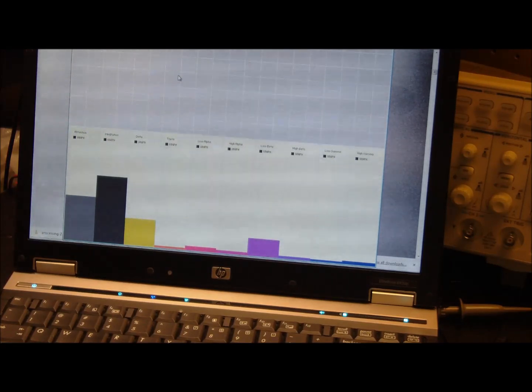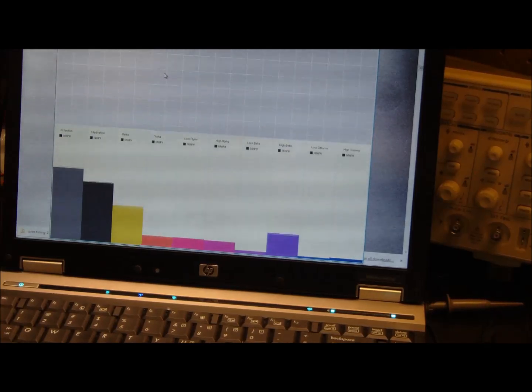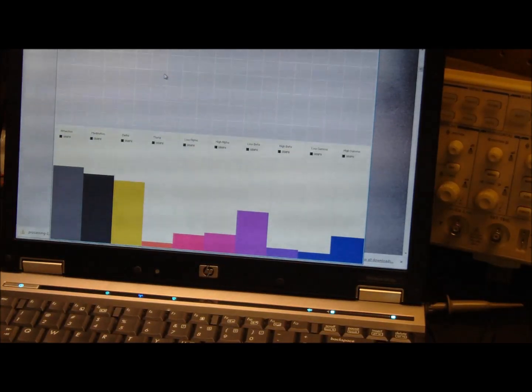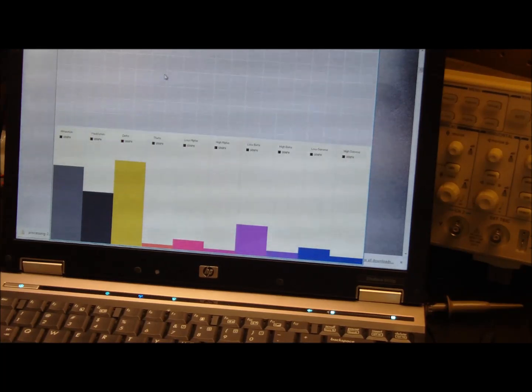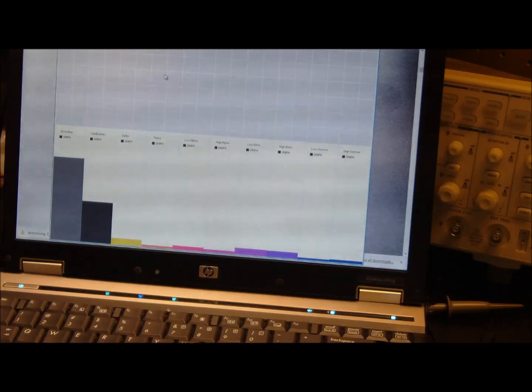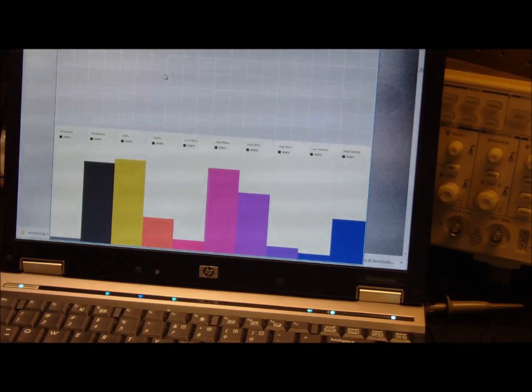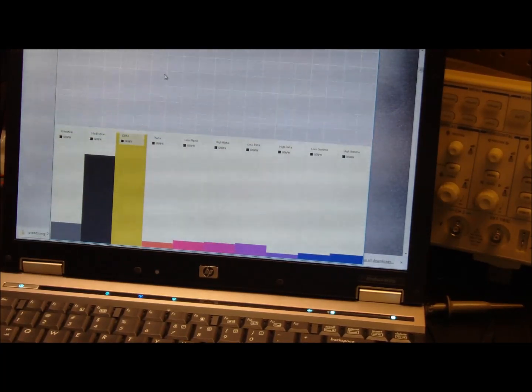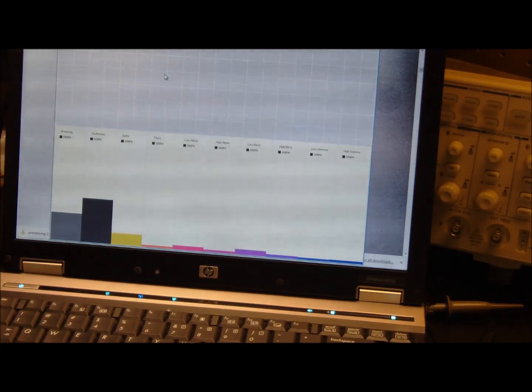I guess I'm pretty relaxed, but anyway, I don't get the graphs at the top, but I'm getting the raw data as I showed before. Too cool, unbelievable, and oddly enough, I do some math or focus on just looking at the keyboard and doing some math with just the number keys, and it puts the attention right through the roof. So I have to say, I think it's actually working. Thoroughly impressed. Obviously some random blips depending on what I'm thinking about and what I'm trying to process.